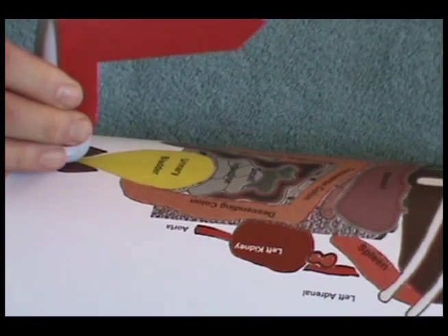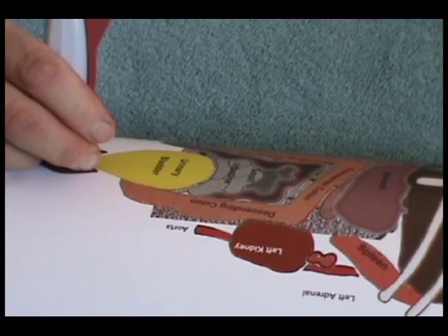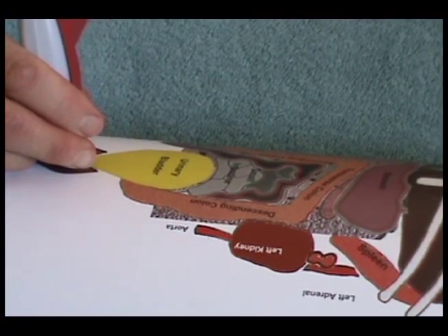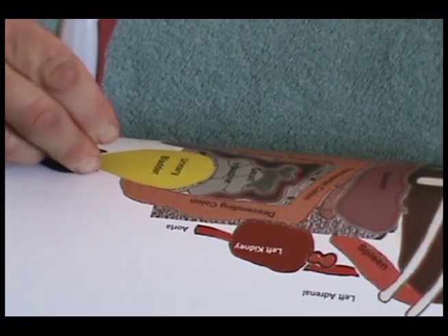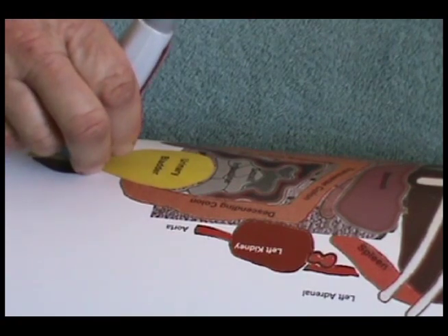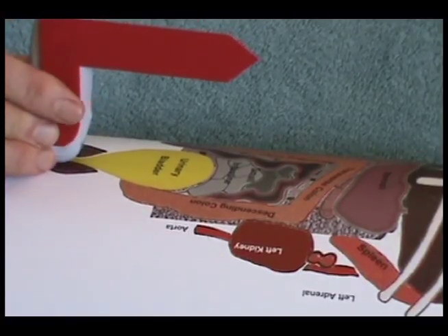Rotate the transducer 90 degrees counterclockwise to a transverse position. Fan the transducer cranially and then caudally till you have seen all prostate tissue. Rotate the transducer back to a sagittal position.